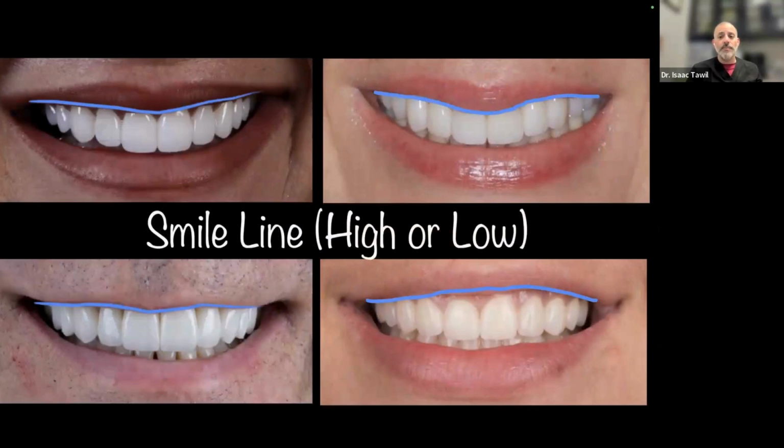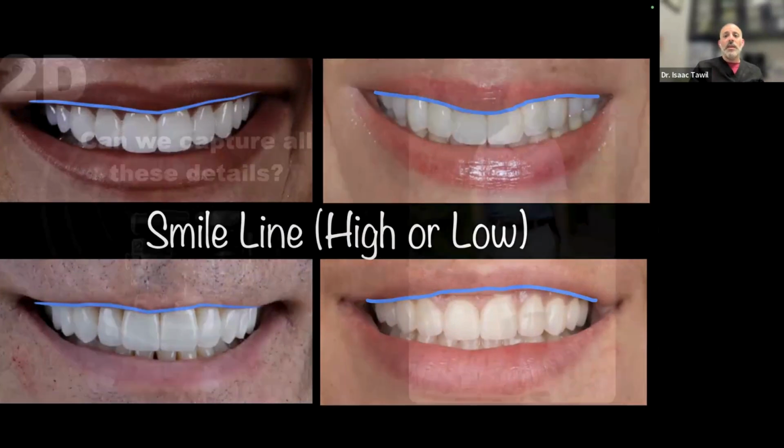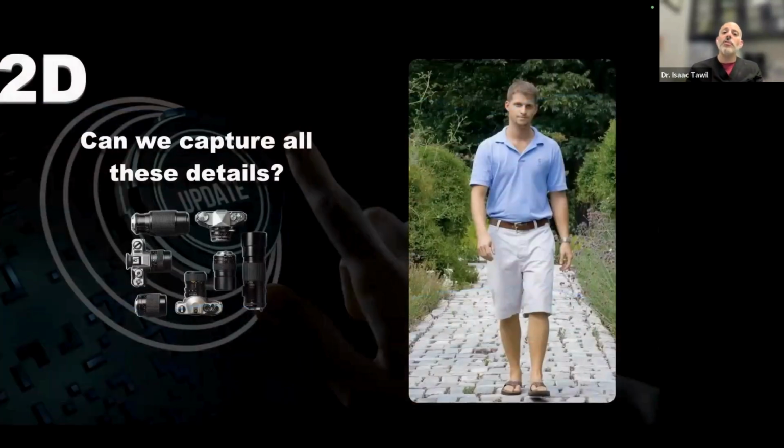But when we don't have those right records, it's hard for us to say this patient has a high smile line or low smile line, and sometimes two-dimensional pictures just aren't enough to be able to determine that. Sometimes they are. So that smile line is going to be our key feature as to what we can do and when we can do things.